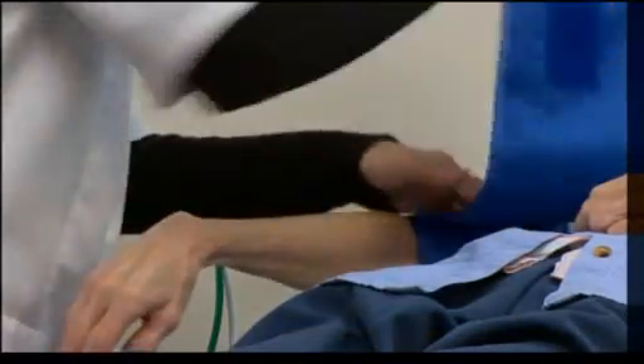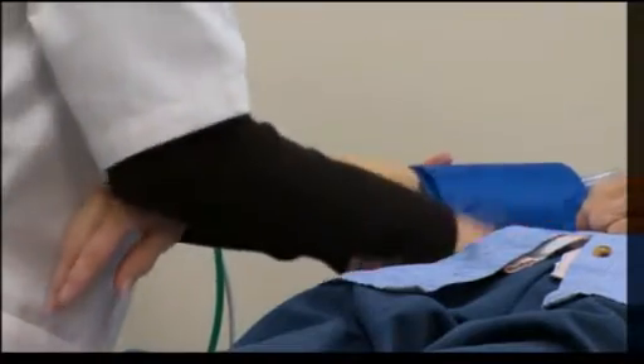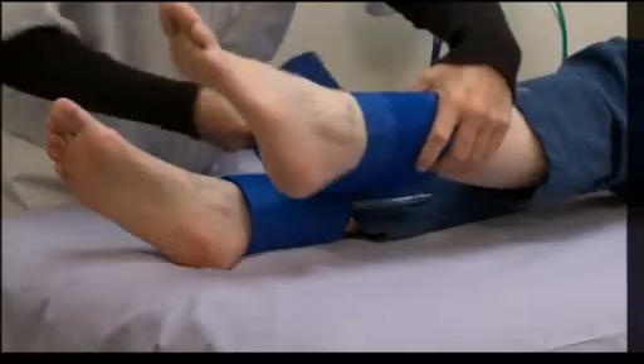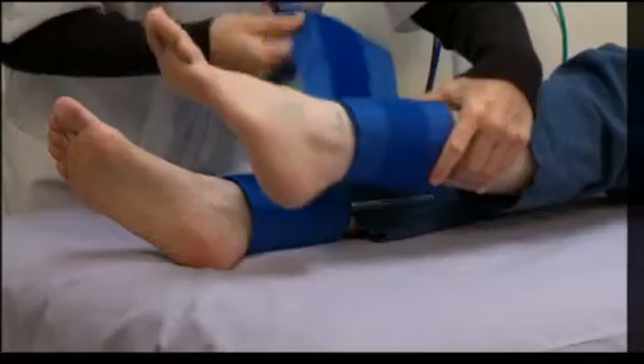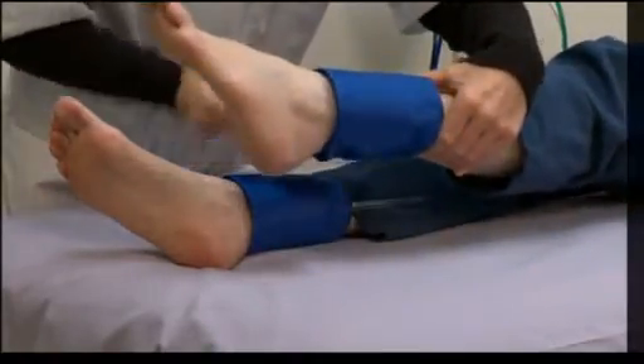Place the cuff as shown here for brachial pressure. Avoid rolling sleeves or pant cuffs in a manner that could obstruct blood flow. For the ankle pressure, wrap the cuff just above the malleolus. Avoid placing the ankle cuff too high, which could result in inaccurate ankle pressure readings.